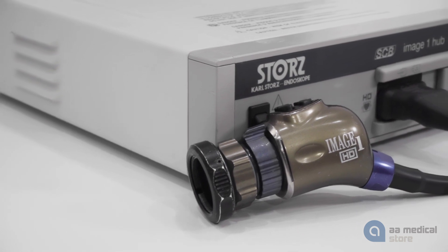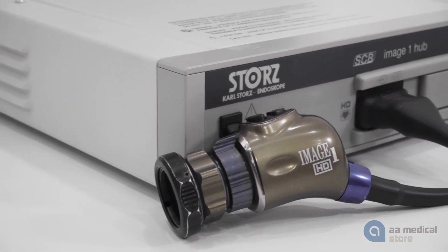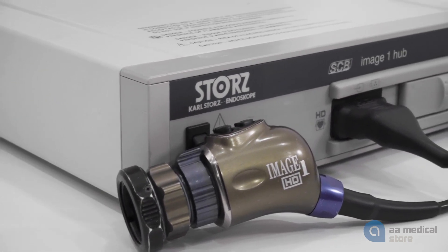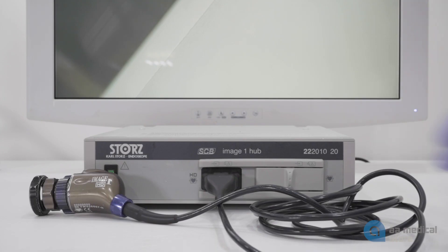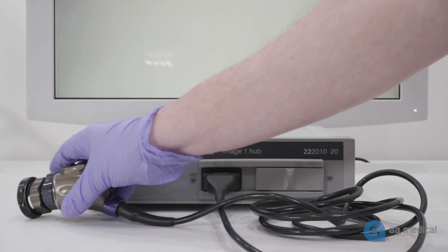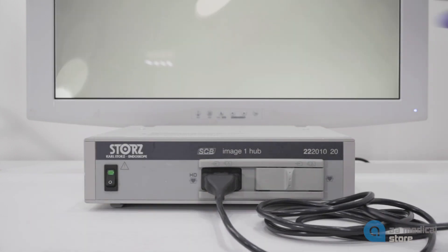Carl Storz's Image One camera heads allow the user to program the left and right buttons on the top of the camera head to perform specific functions.